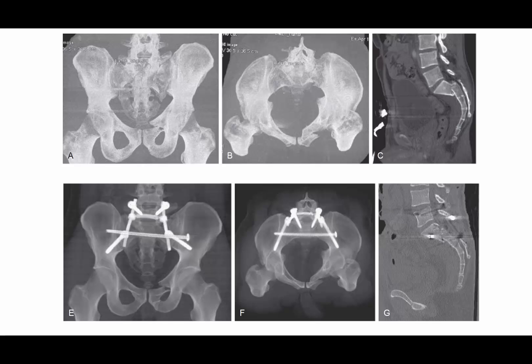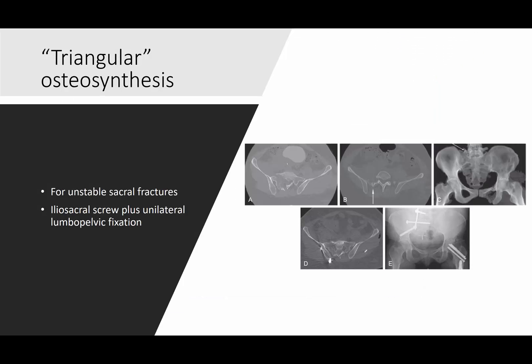Here's an example of a pelvic ring injury combined with a sacral fracture — probably a U-shaped type injury with a Roy-Camille type 3 injury — treated with a transiliac transsacral screw and a lumbopelvic construct, with improved alignment shown on the post-reduction CT.